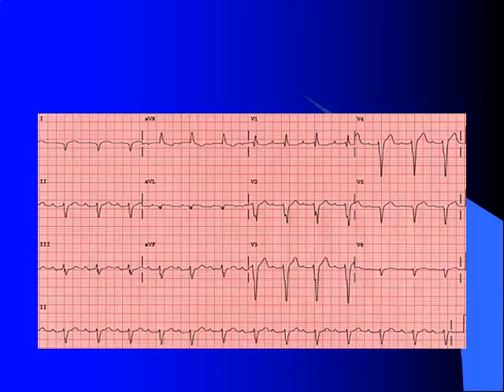It looks like you have a severe problem with either right ventricular dysplasia or right ventricular hypertrophy to a very extreme level. But in this case, we have our axis of negative 150 degrees, or an extreme right axis deviation.